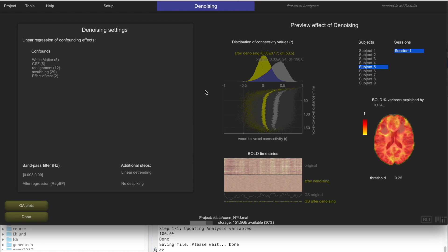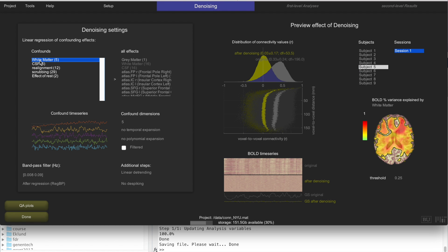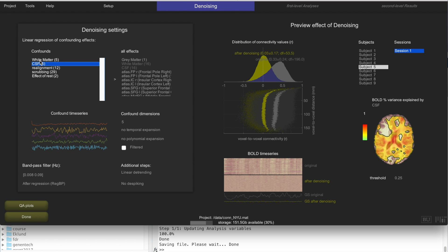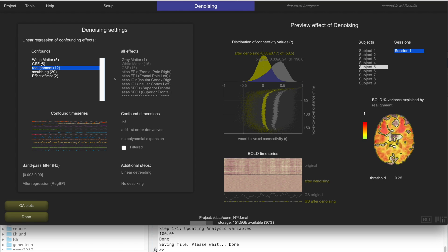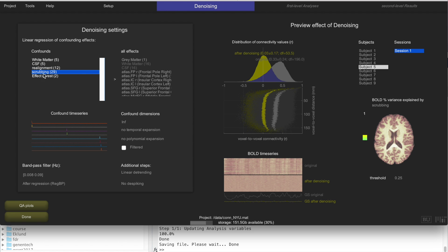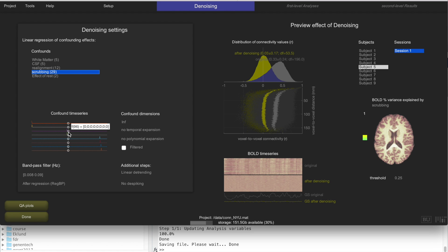There are many methods available in CONN to do this, but the default method is called anatomical CompCor. It extracts a representative noise signal from white matter regions and from CSF, then removes anything that correlates with those noise components from the BOLD signal for every voxel. It also removes anything that correlates with realignment parameters, subject motion parameters, and scrubbing covariates — effectively taking out outlier scans. All of these are removed in a single linear regression step, with the residuals being your clean signal.